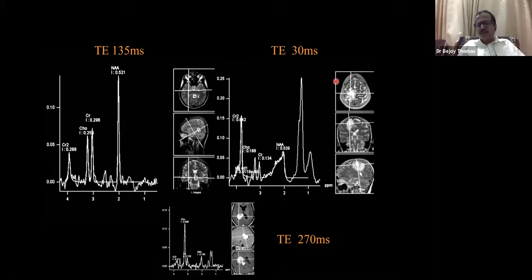Previously we used to do the STEAM sequence. I will not go into the details of these sequences, but PRESS is a point resolved spectroscopy sequence, but that is not really important. More important is the TE value you are using, because depending on the TE, the spectrum can change. For example, this is the spectrum at TE 30, and this is the intermediate TE, which is 135 milliseconds or 144 milliseconds, depending on the machine you have. Basically, they give a similar result.